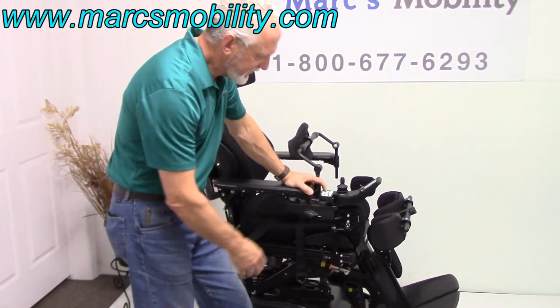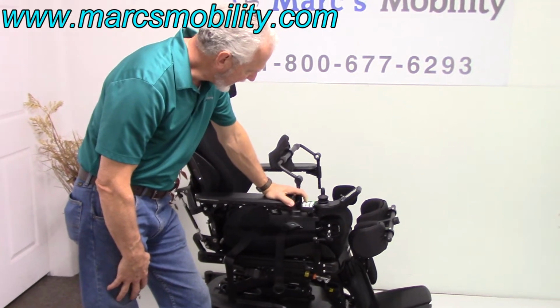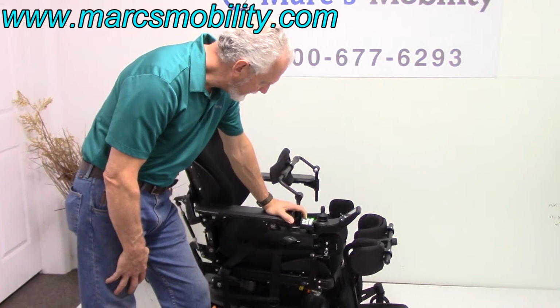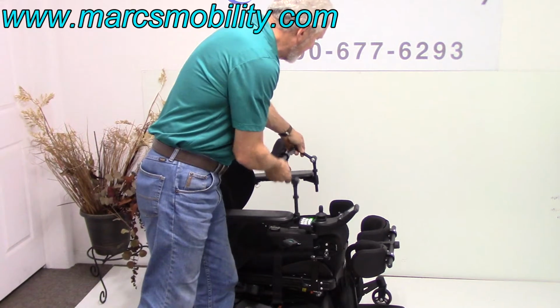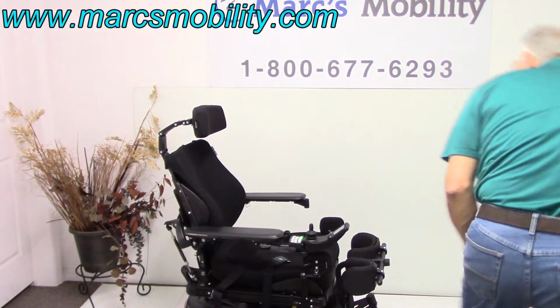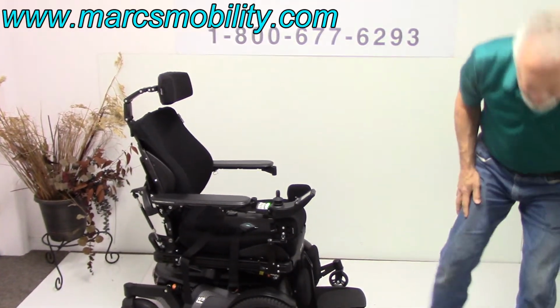So I'm bringing, see how the wheels came back off the ground there. That was nice. So now I'm bringing the seat all the way back down to normal settings. That's just an amazing chair, what it does. I'm going to take the chest guard off. I'm going to take the knee brace off. And now we're going to talk about the seat lift.